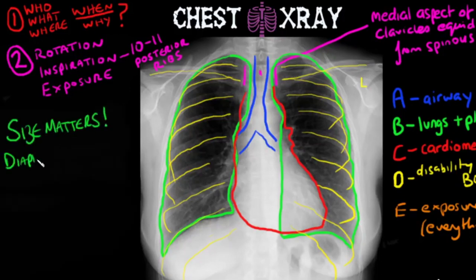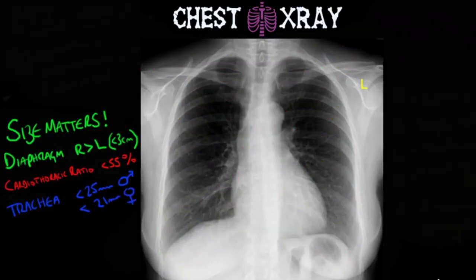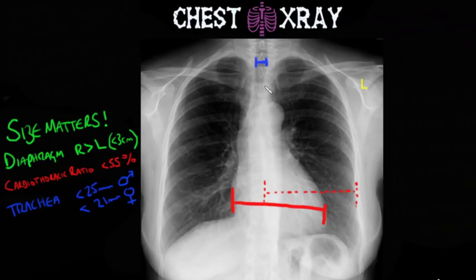Now we are going to start comparing sizes of different anatomical structures. For the diaphragm, the right diaphragm should be higher than the left, but no more than 3cm. In terms of the heart, the cardiothoracic ratio should be less than 55%, meaning the heart should fill no more than 55% of the thoracic cavity. The trachea should be less than 25mm across in a man and less than 21mm in a woman.